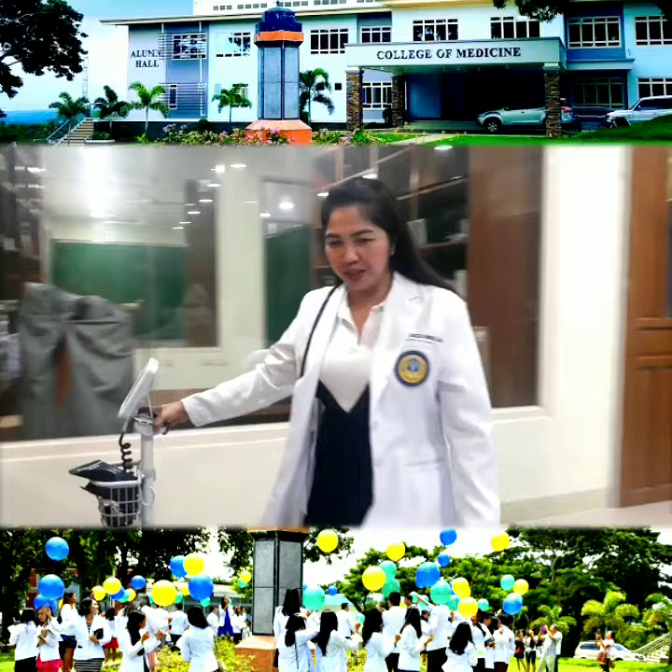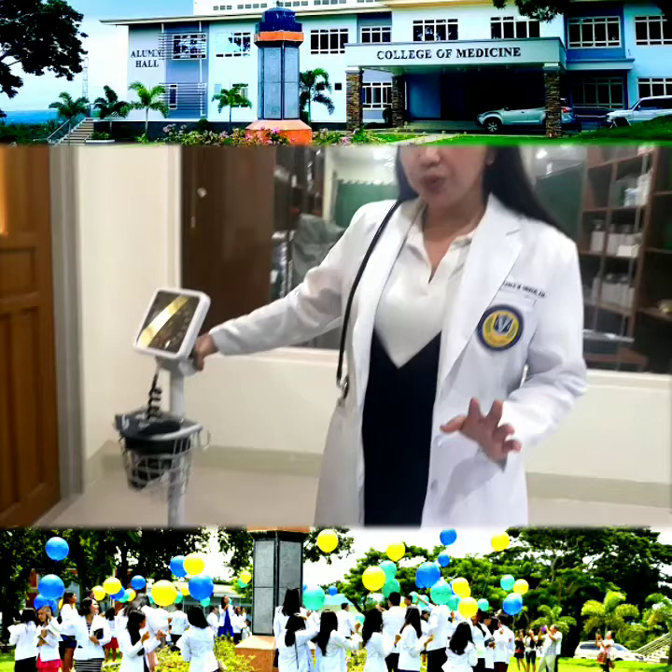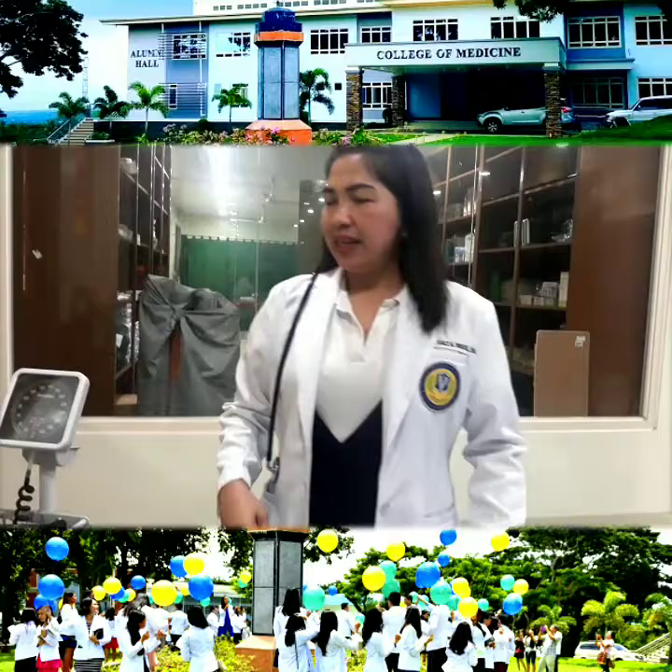Good morning, Mr. Smith. How are you today? I'm here to take your vital signs. I'm going to take your blood pressure, pulse rate, and your respiratory rate. This is very important for us to be able to assess your condition.